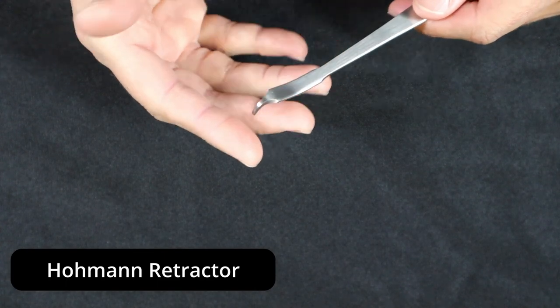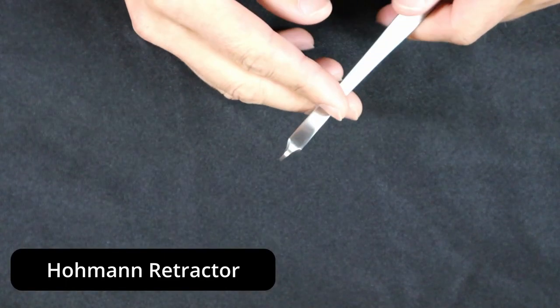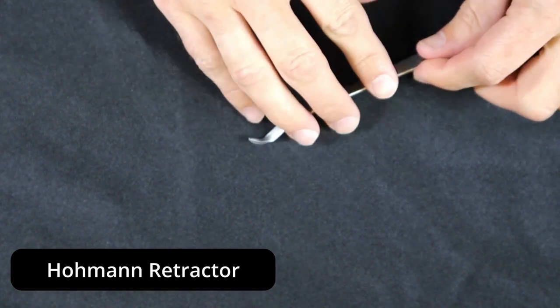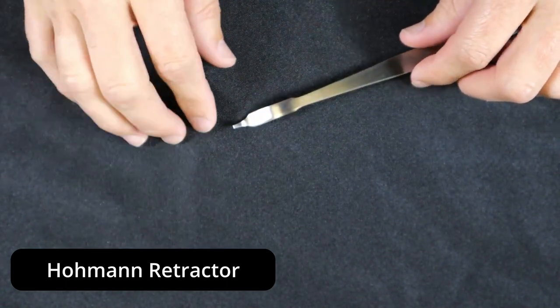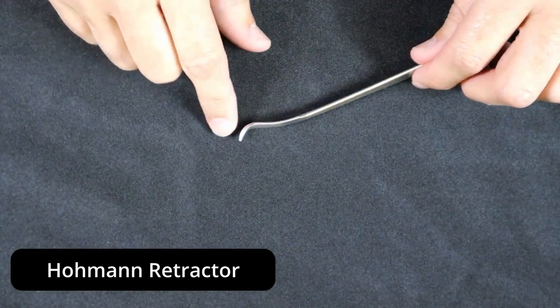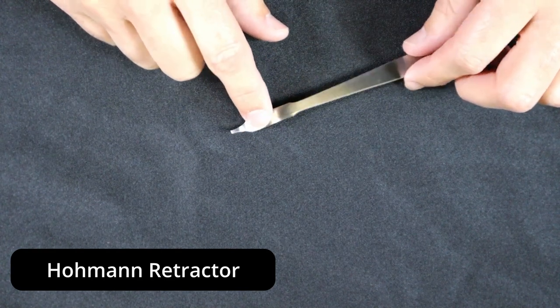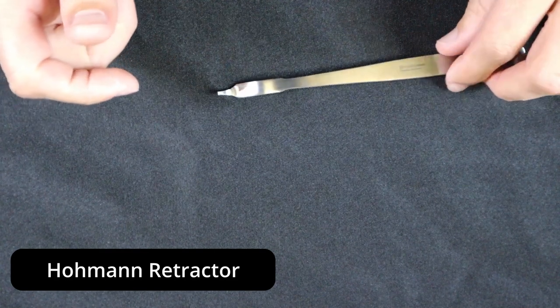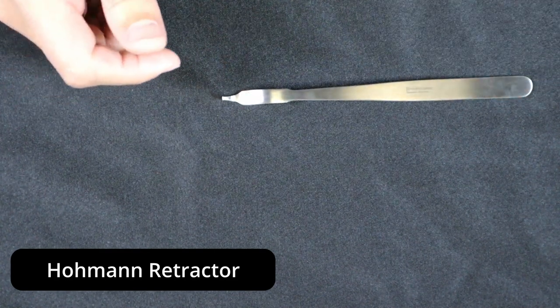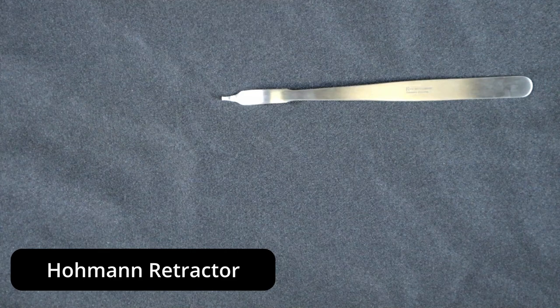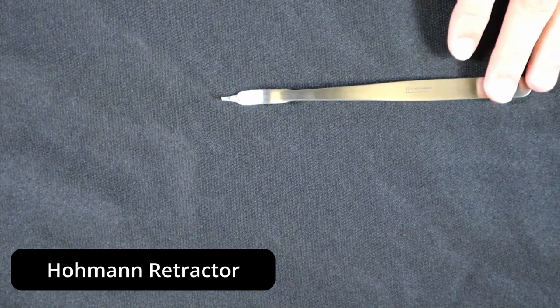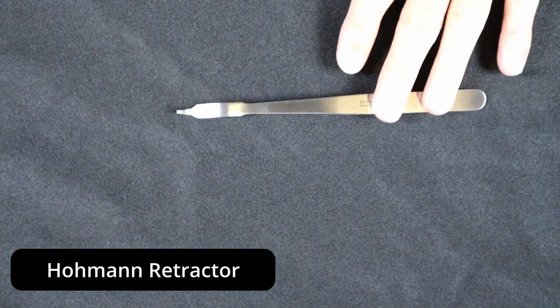You do want to be aware that all instruments need to be in working condition. If you see a Hohmann come back that's clearly bent out of its original profile, or there's a chip or divot that's making it difficult to clean, that device needs to be taken out of service and either repaired or replaced by the instrument provider.